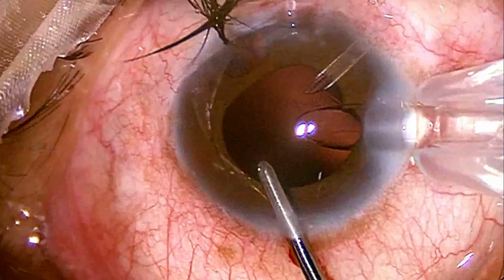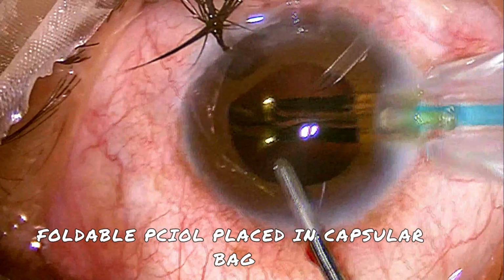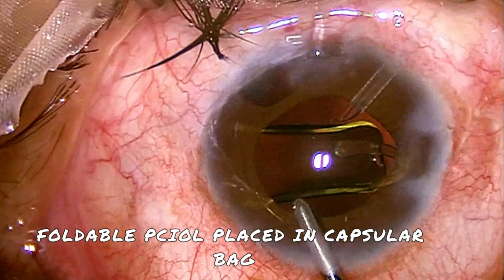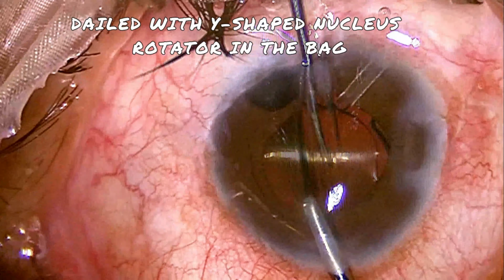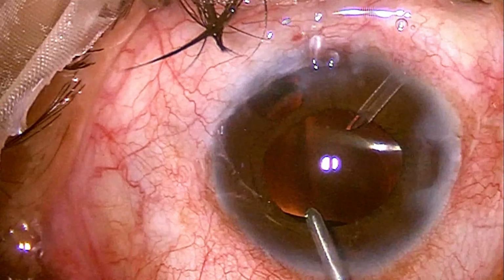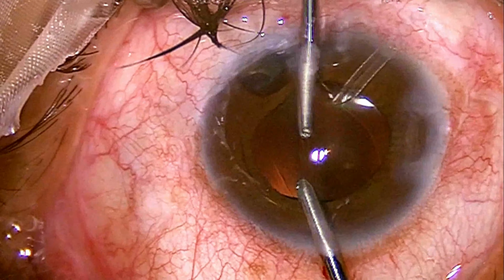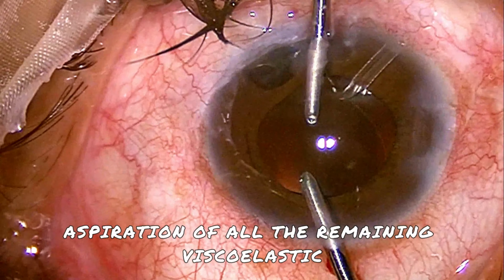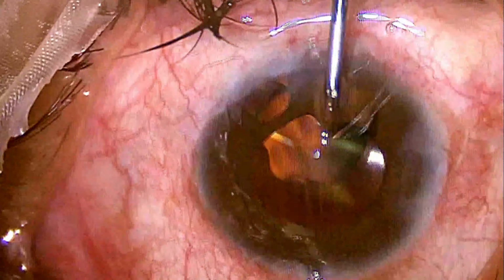Now a foldable posterior chamber intraocular lens implantation is being done under irrigation to prevent any visco going into the Ahmed glaucoma valve tube, which may occlude the tube later on. Just in case there is any viscoelastic substance remaining, irrigation and aspiration is done to remove it.